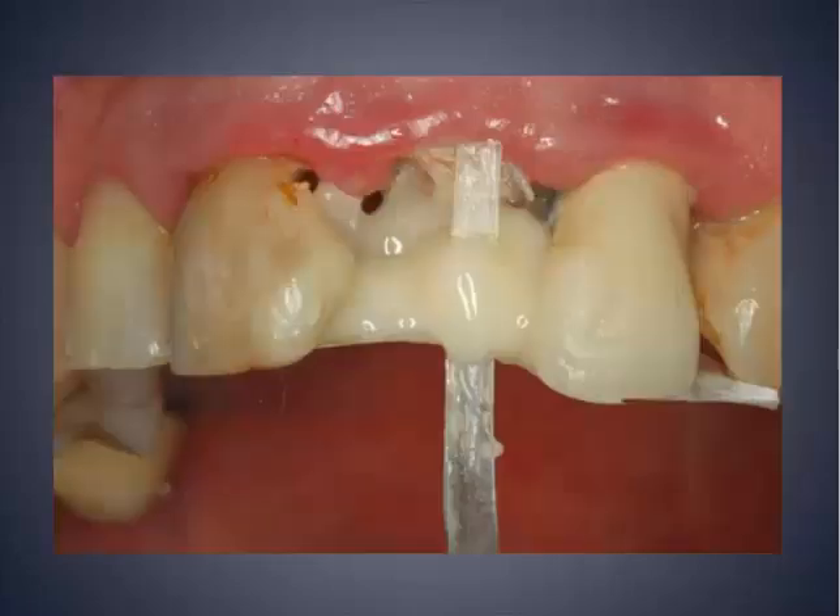Here's what I did: Futura Bond DC. I acid-etched first, of course. Then I placed two Grand Tech fibers across for two reasons. One, this tooth was severely carious. Two, I had a porcelain crown there and I wanted to try to get as much adhesion to the porcelain crown as possible. I even placed a Grand Tech fiber up and down for extra reinforcement, because I was going away for eight or nine days and just didn't want this thing to come out and break.